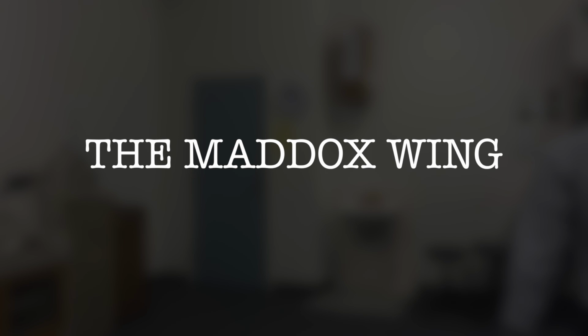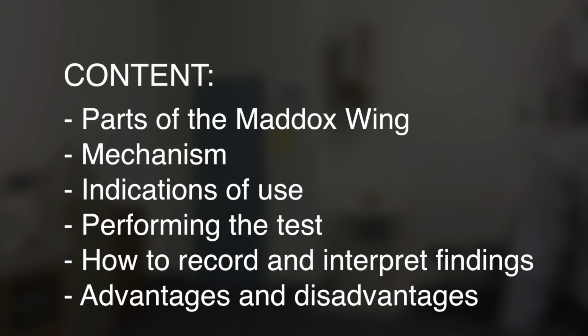Hi, this is an instructional video on how to perform a Maddox Wing test aimed for orthoptists. In this video, we will be explaining the following: parts of the Maddox Wing, the mechanism, indications of use, how to perform the test, how to record and interpret your findings, advantages and disadvantages.